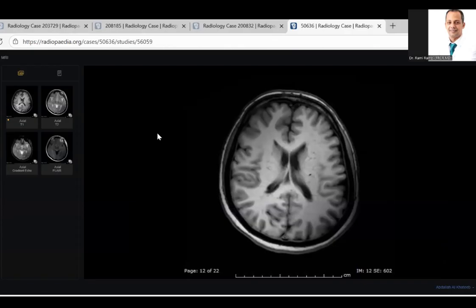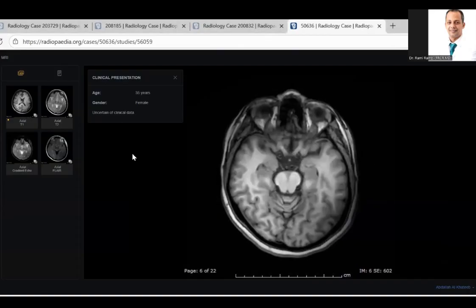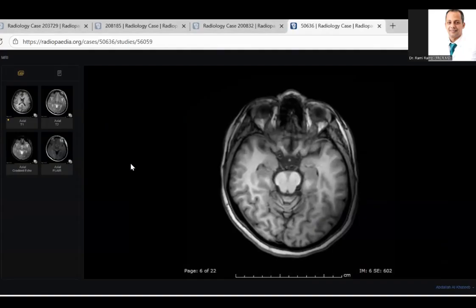Assalamu alaikum. Wassalam, doctor. Doctor, this is a 35-year-old female patient presented with a chronic headache. Go on. Okay. One second. I am trying to scroll.